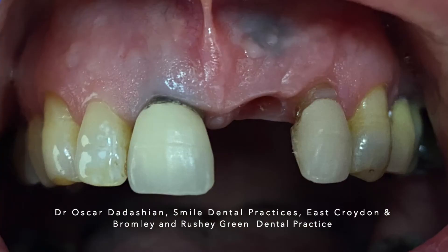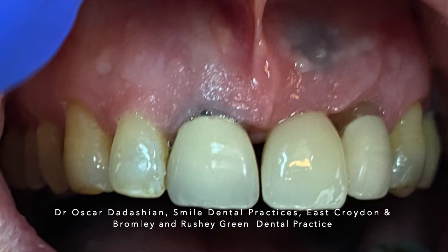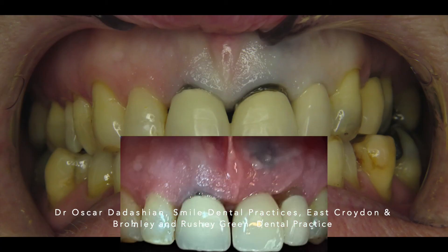This is three months later at the time of fit. Converting an extraction socket type 2b to this beautiful ridge with plenty of keratinized tissue was only made easier by performing socket preservation at the right time. We could have achieved similar results by doing bone augmentation alone, but the surgery was made a lot easier since the socket was preserved. You can see the gingival margin not differing hugely from the pre-extraction photograph.